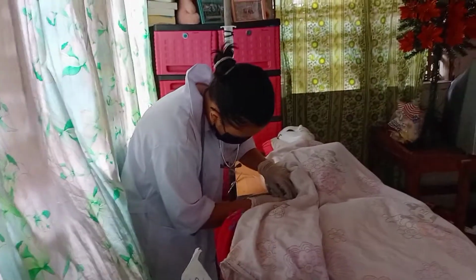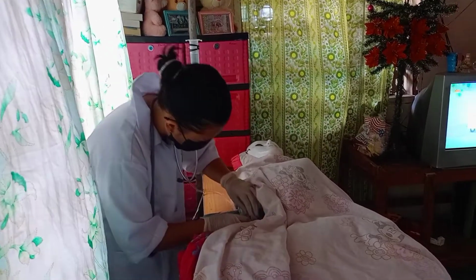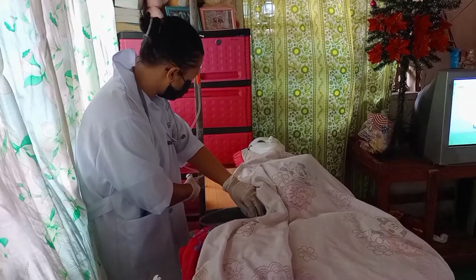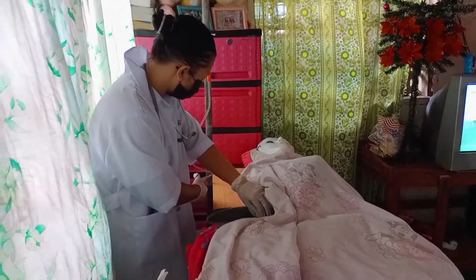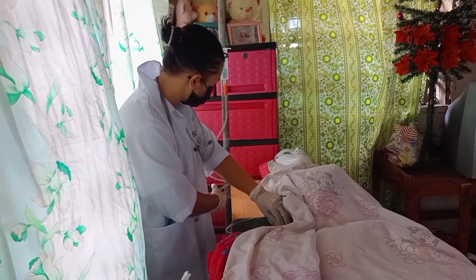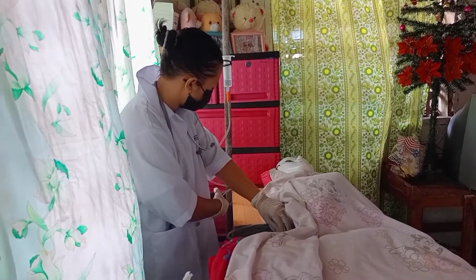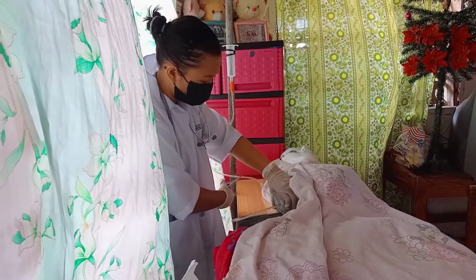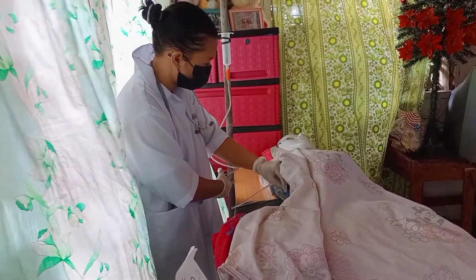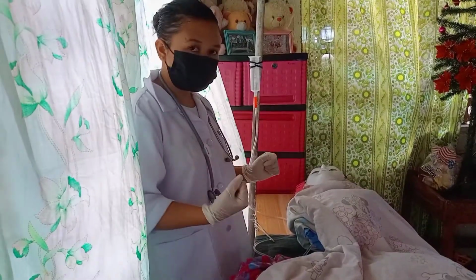Administer the enema properly. Also, administer the fluid slowly. If the client complains of fullness or pain, lower the container or use the clamp to stop the flow for 30 seconds and then restart the flow at a slower rate. Administering the enema slowly and stopping the flow momentarily decrease the likelihood of intestinal spasm and premature expulsion of the solution. Next is clamp the tube, gently withdraw the rectal tube.